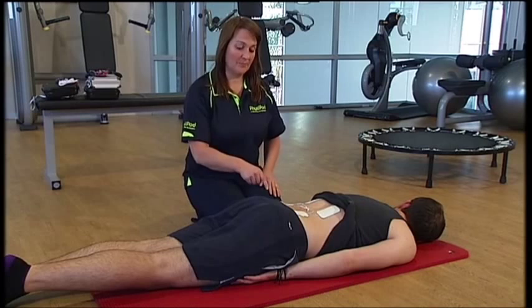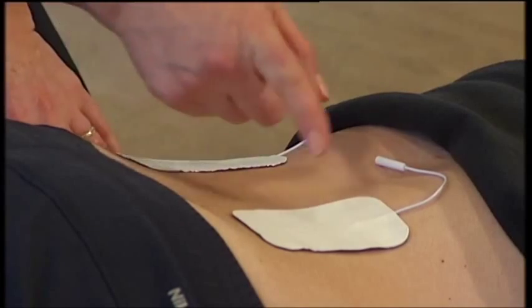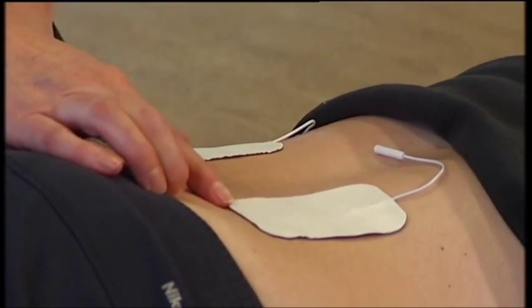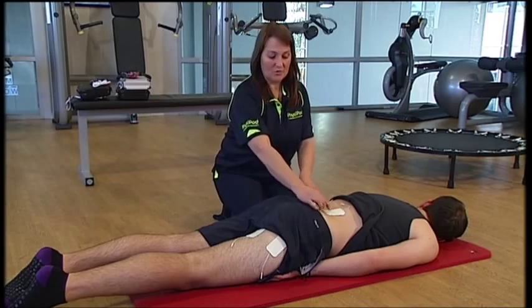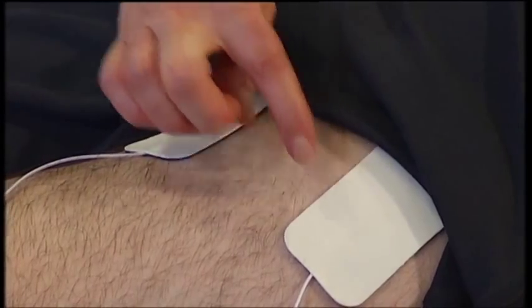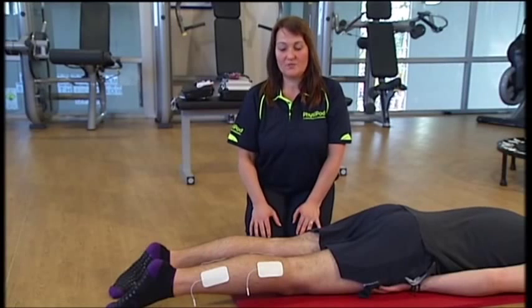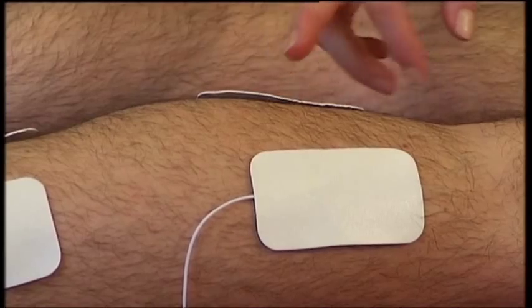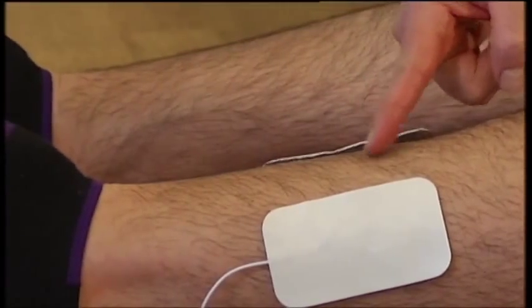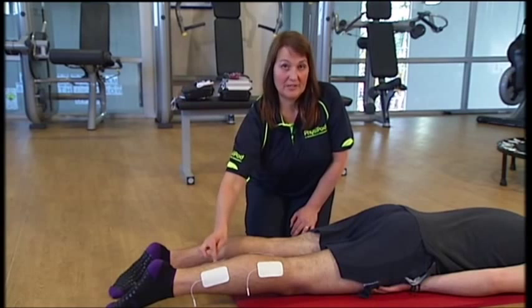If you had a lower back problem, you would attach four electrodes roughly circling the main area of pain. For lower back pain with associated buttock or thigh pain — some sciatic radiation — put two either side of the main pain in the back and two just below where the sciatic nerve exits the buttock. The sciatic nerve comes off the lower back, passes through the mid-buttock and down the thigh. The placement shown on the leg here would be ideal for someone who'd recently torn or strained their calf muscle: two on either side of the calf muscle at the top and two electrodes lower down. The electrodes should not be any closer than around five centimetres apart, otherwise the current will jump into the other electrode rather than into the body.